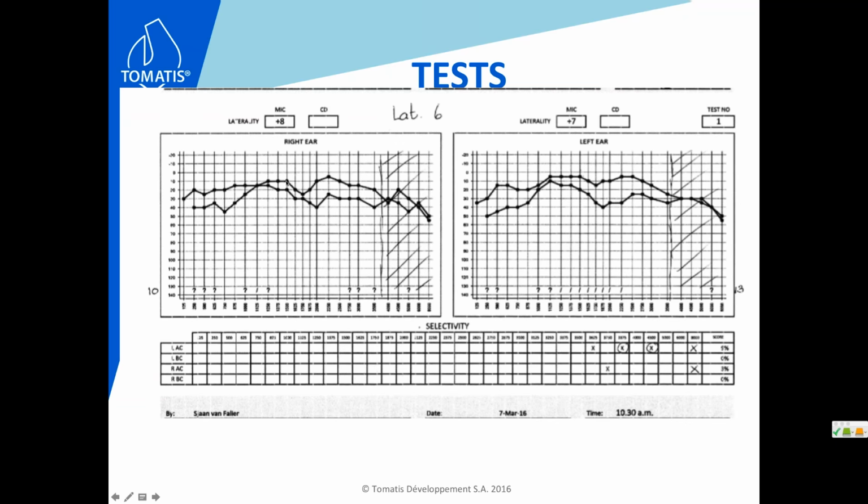That in the linguistic area, because we're in the middle of the linguistic area, when you have a gap like this, it means that you have to send sounds stronger for him to react to them. Remember also that the air curve is the one that puts us into contact with others.